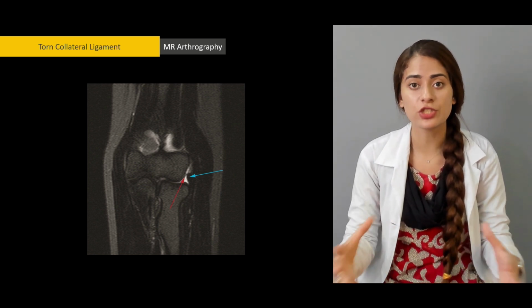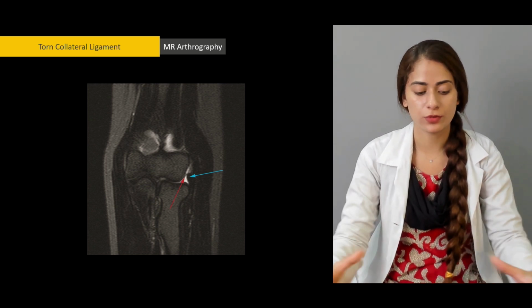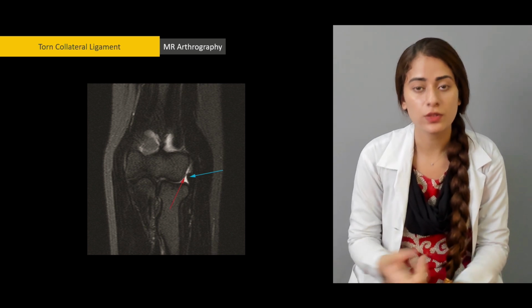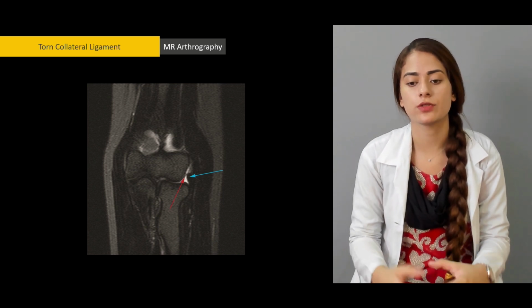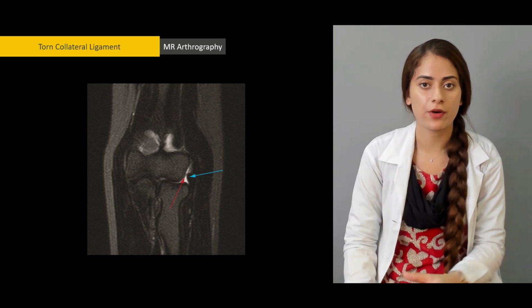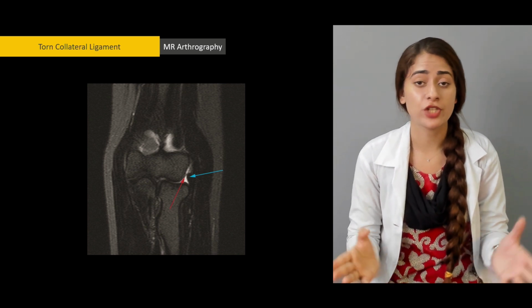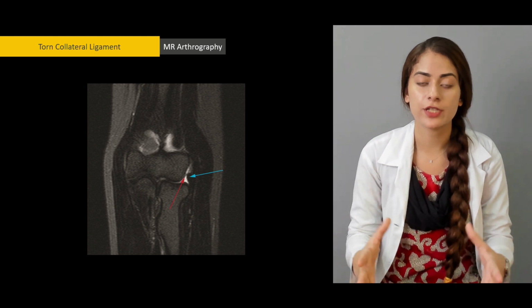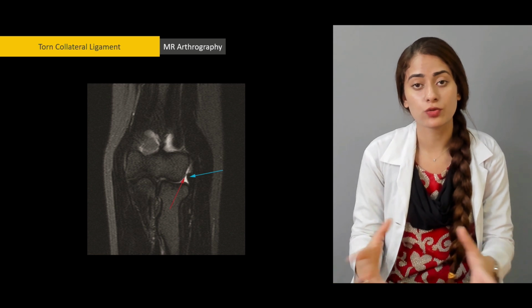So that is how you reach a diagnosis: you take into account all of the different views, the entire history, other medical tests, and then you reach a diagnosis. Otherwise, it's not easy to diagnose on MRI without knowing the history, without knowing the entire case, without knowing the gender or the age, because it is different. The fracture classifications are different for genders or age groups.